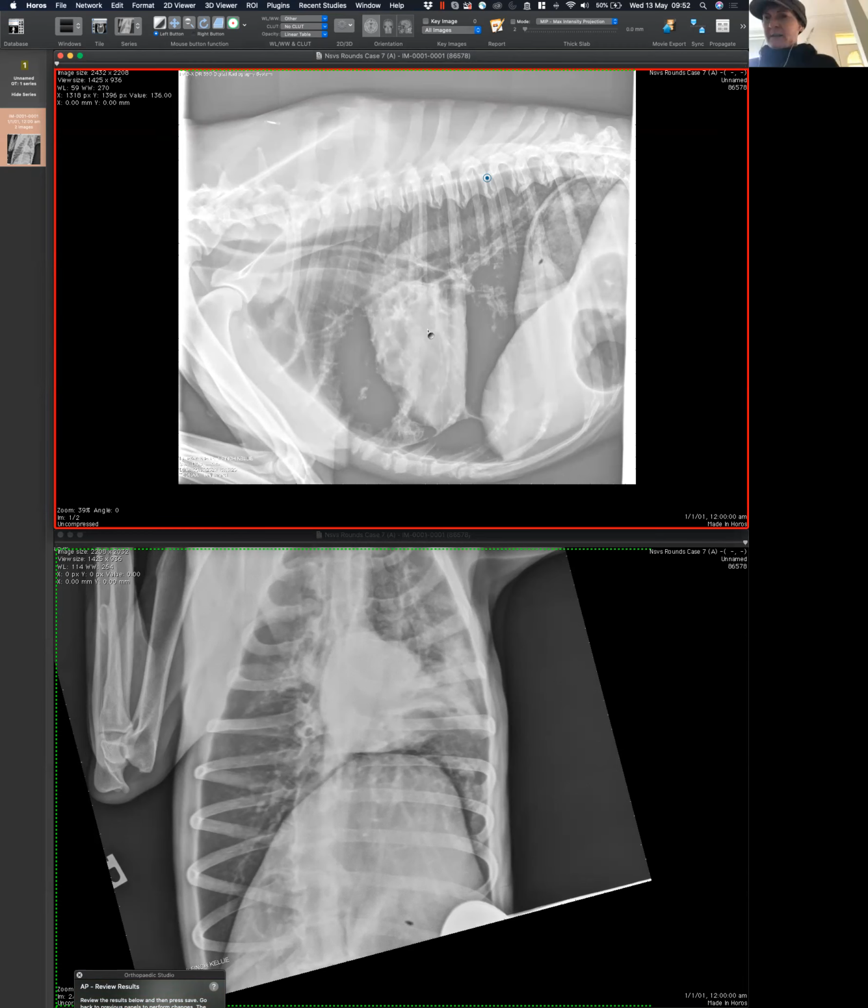Oh, I had a quick question just when you were talking about the bronchial pattern being visible there because they're large bronchi. Do you understand that if you were to want to interpret that as being pathological, do you need to see a bronchial pattern in a more generalized area? Like if bronchial pattern is real, is it always generalized or can it be localized? Okay, a good point.